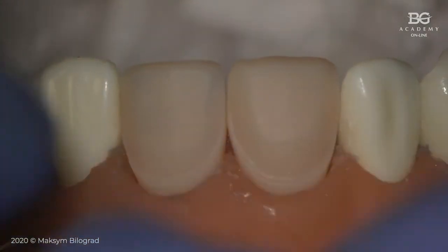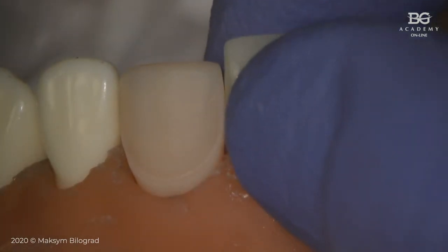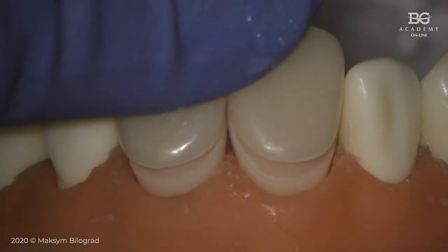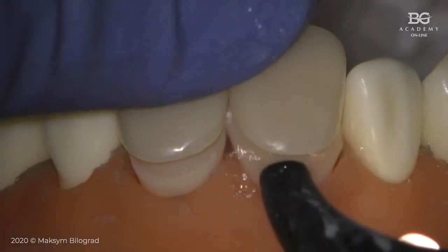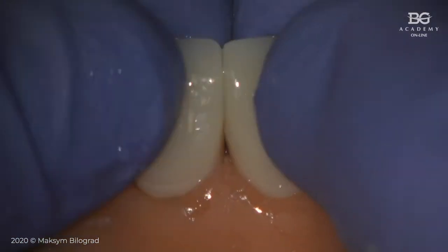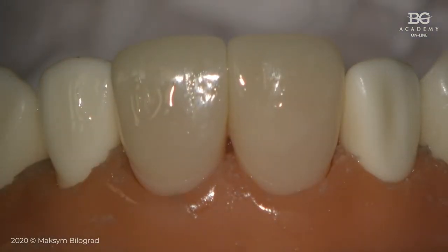In some cases, you even can do try-in with just water. Okay, we put veneers on teeth. In our case, we will put some water underneath. Okay, that will help us not to get this opaque thing. So we put multiple veneers, and during this step of try-in, we are evaluating color and we are evaluating shape.